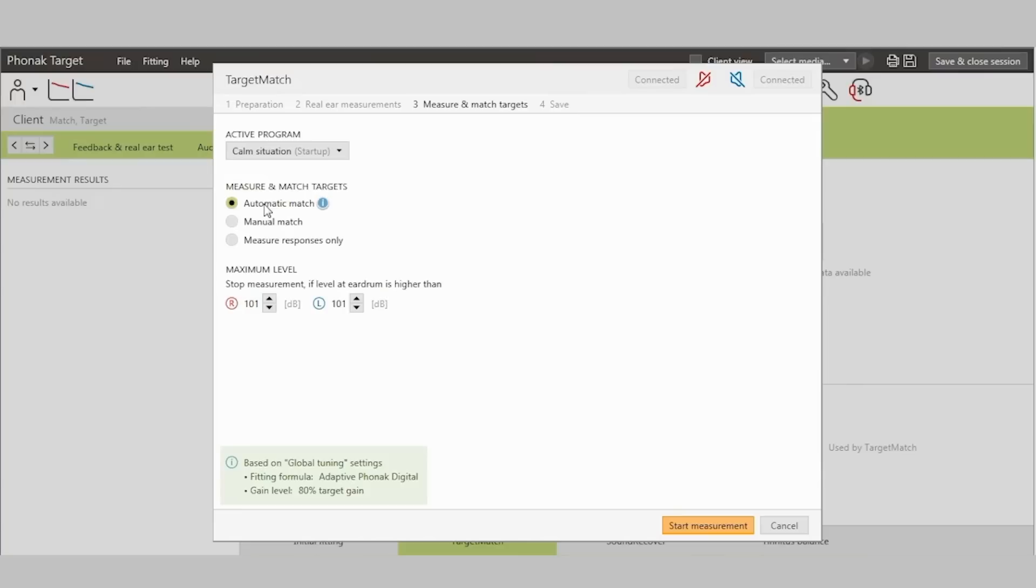In addition, an overview of the fitting formula and gain level being applied for this target match session can be reviewed in the lower left-hand corner. Press Start measurements to measure and match targets.